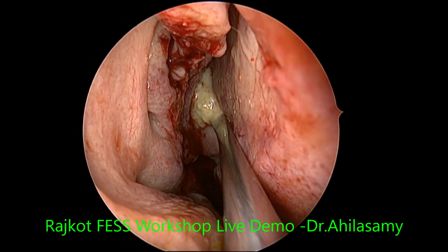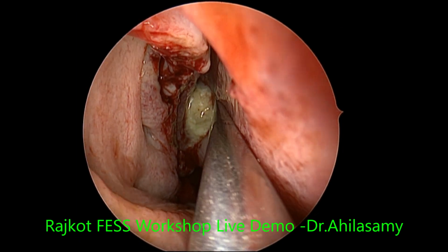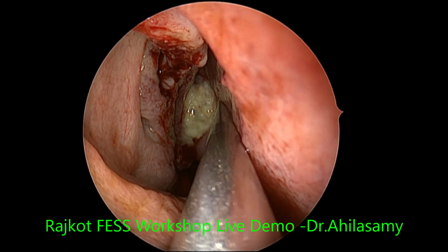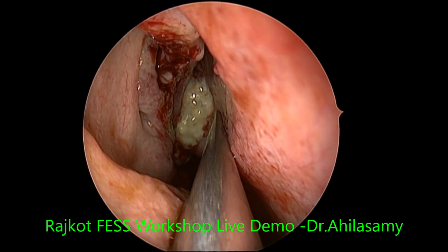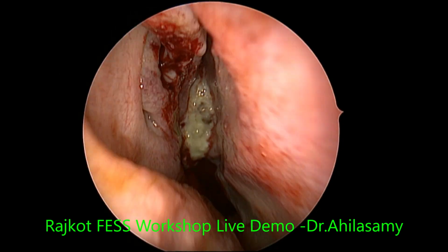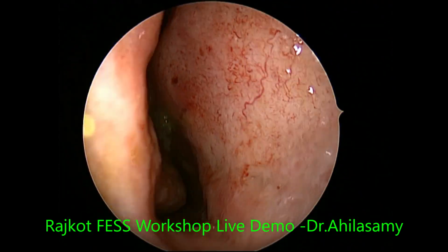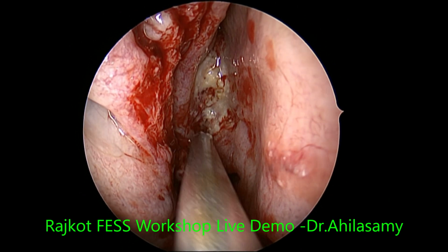See, the pus is coming. That's the beauty. Just press. You need not cut. Press it medially, laterally, inferiorly. The ostium becomes very big and open. And for extra widening, you can use a Kerrison to take out the bone. But with pressure itself, medially, laterally, inferiorly, you can widen the ostium, how you saw it just now.